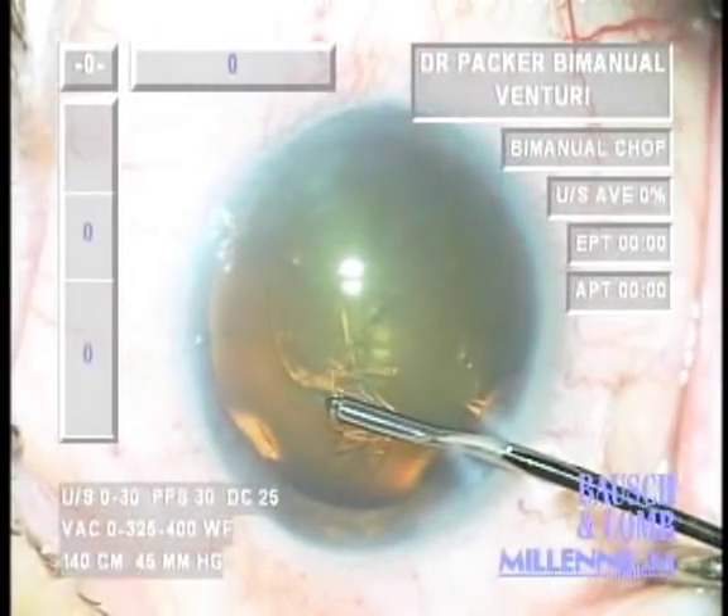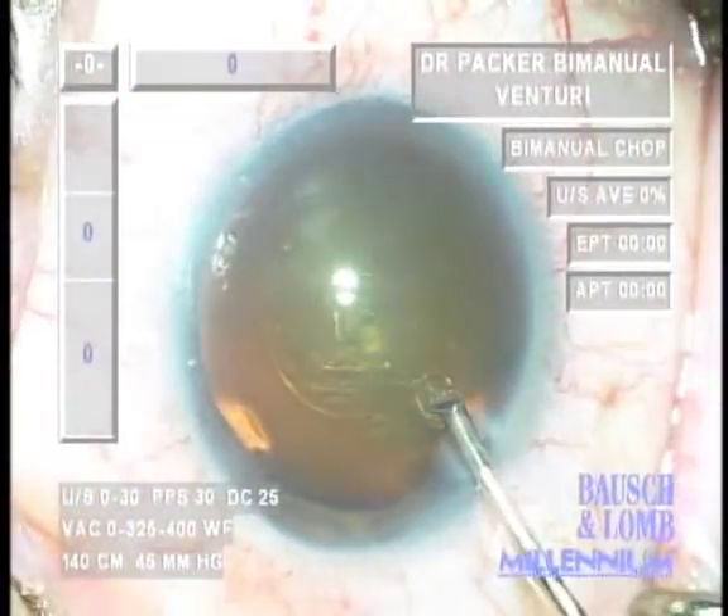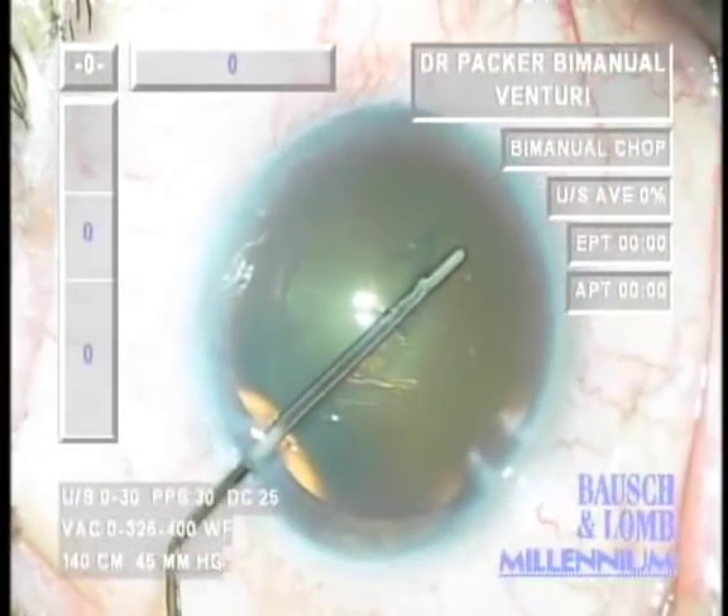This is increasingly important with newer generation intraocular lenses including multifocal, square-edge, and accommodative lenses, which demand a more consistent, centered, and round capsulorexis.